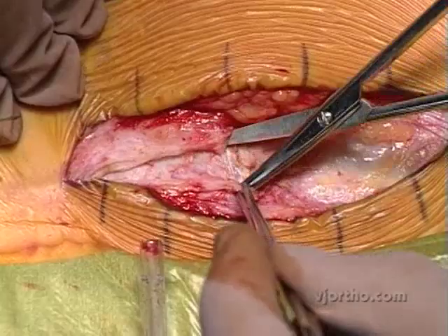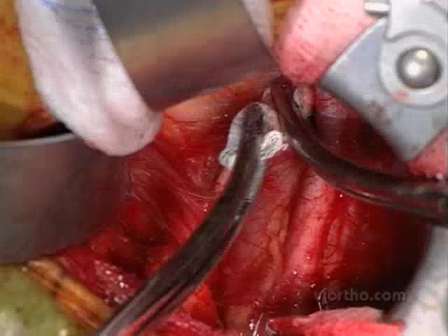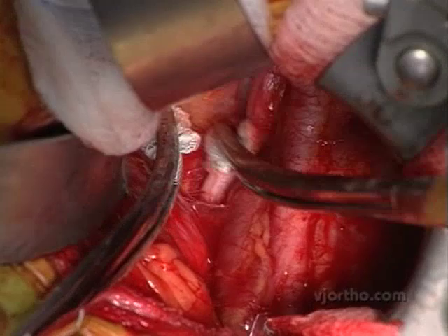The rectus abdominis muscle is coming away from the midline. This is the left common iliac vein, which is really the most critical vascular structure we have to move out of the way and retract in order to do the discectomy and the arthroplasty.